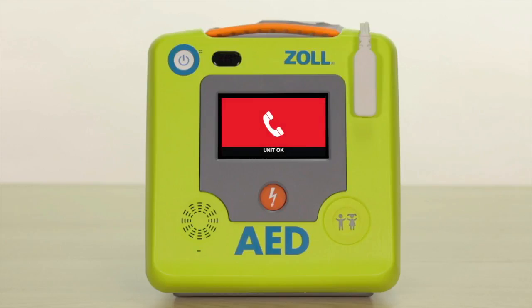Note that if you do not select the blue gear configuration icon within 30 seconds, the AED3 will automatically go into rescue mode.